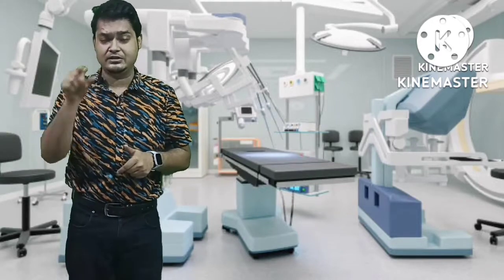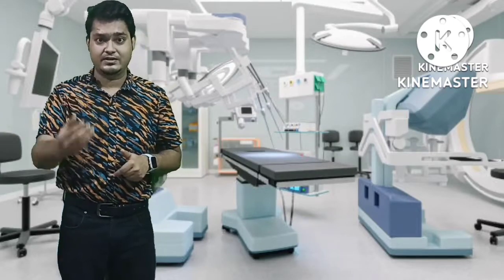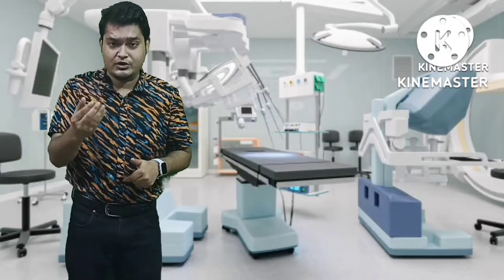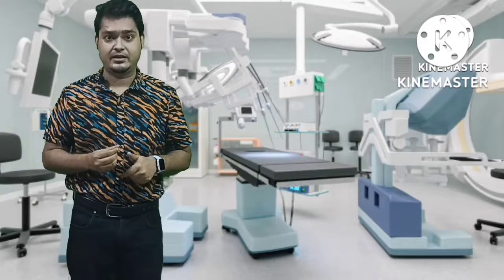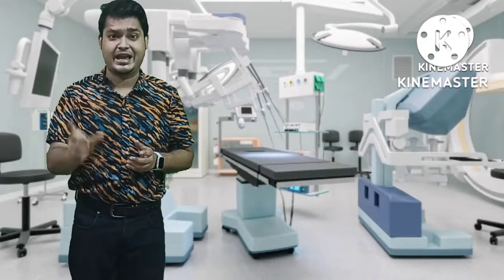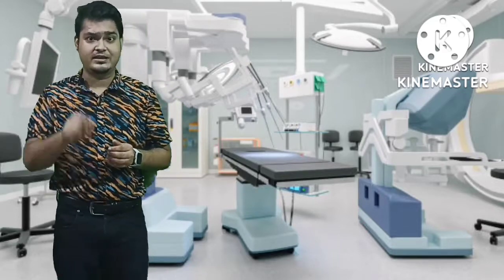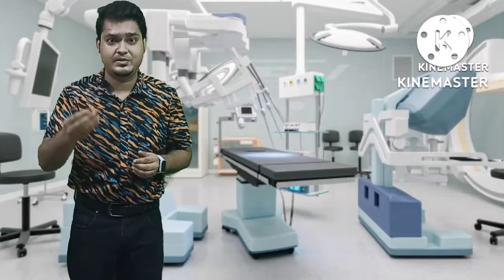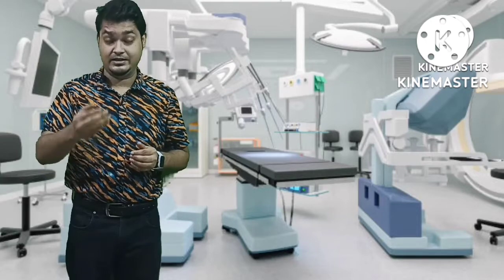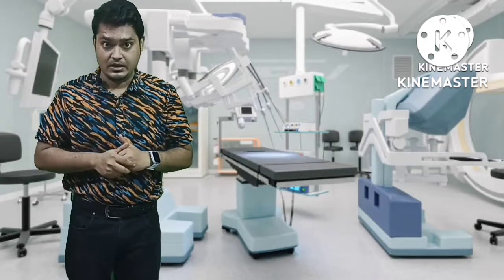So in traditional coronary angiography, in catheter angiography, we administer a radiological contrast media with the help of the catheter to delineate the arteries of the heart which are supplying the heart muscle, to detect any kind of heart blockage, and if we find any blockage then we can also perform the treatment, or we can open or clear that blockage in traditional coronary angiography, in the catheter angiography.